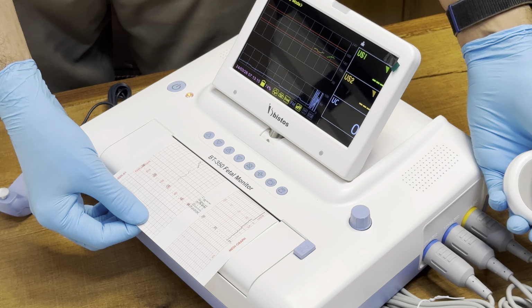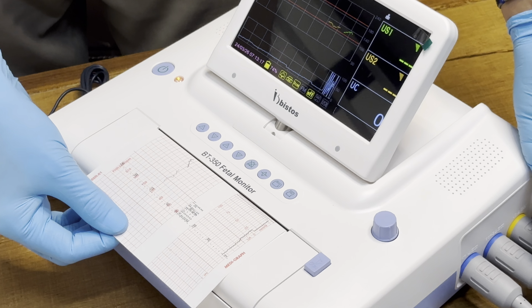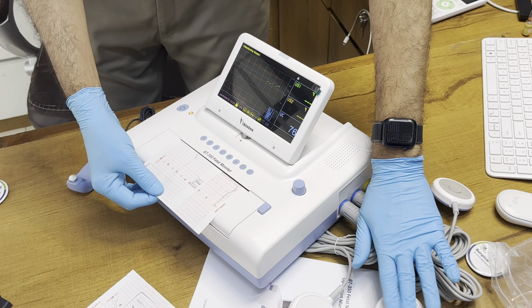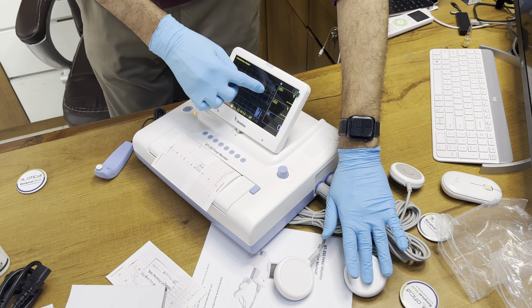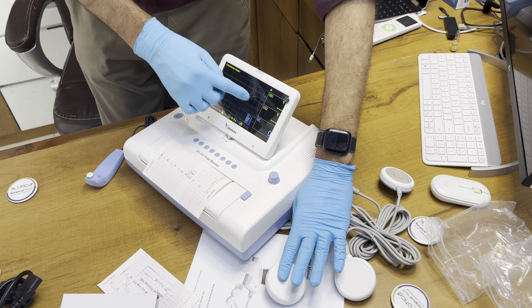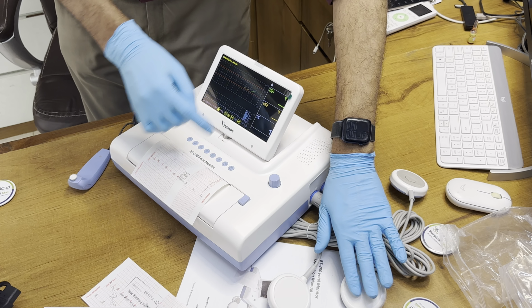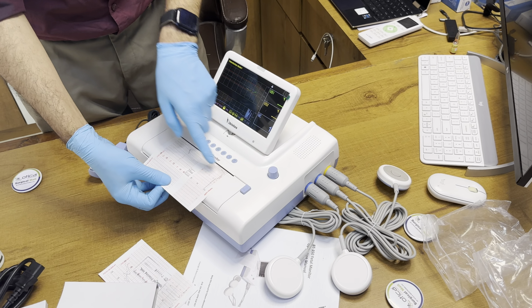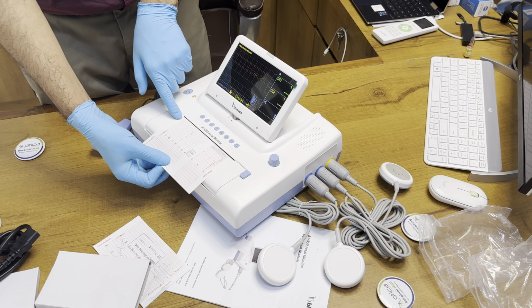Printing will be done at 3 cm per minute as per the setting. As there was no heart rate, it has been blocked. But when you connect it to the patient with the help of the belt, it will give you the proper resolution, and you can see this is how it has been printed.